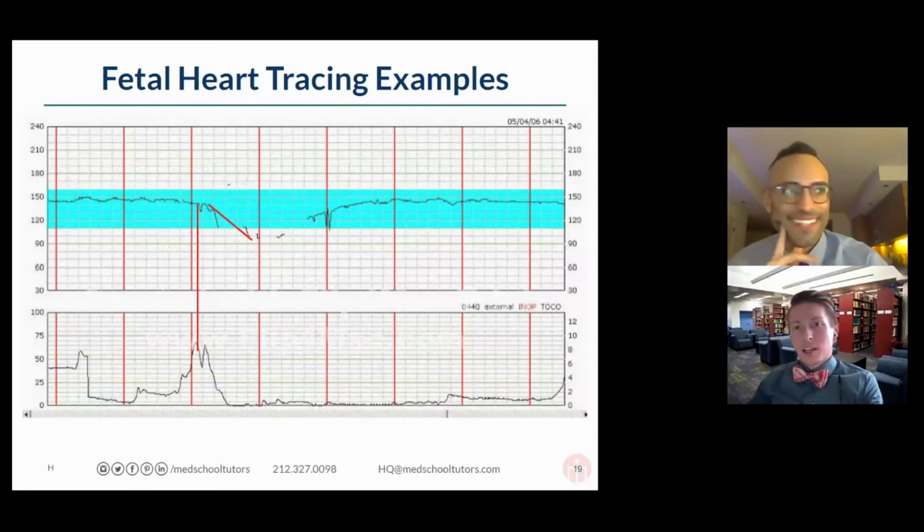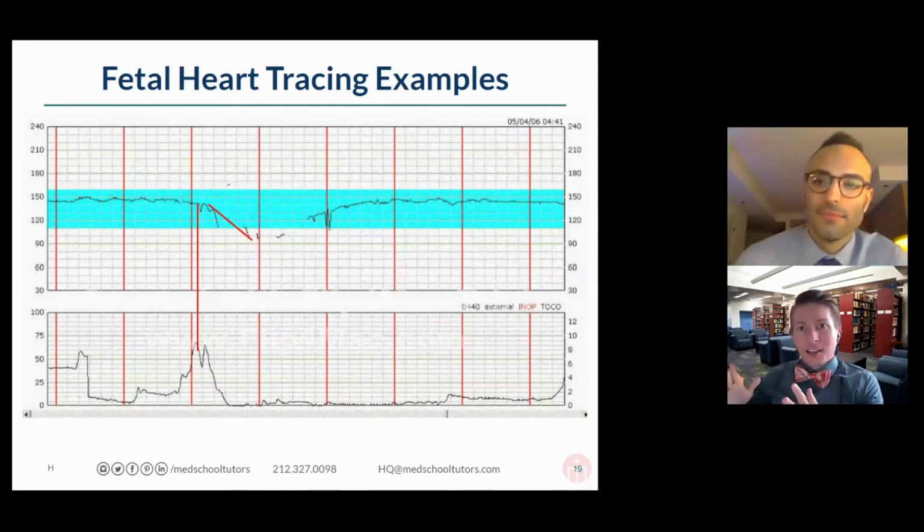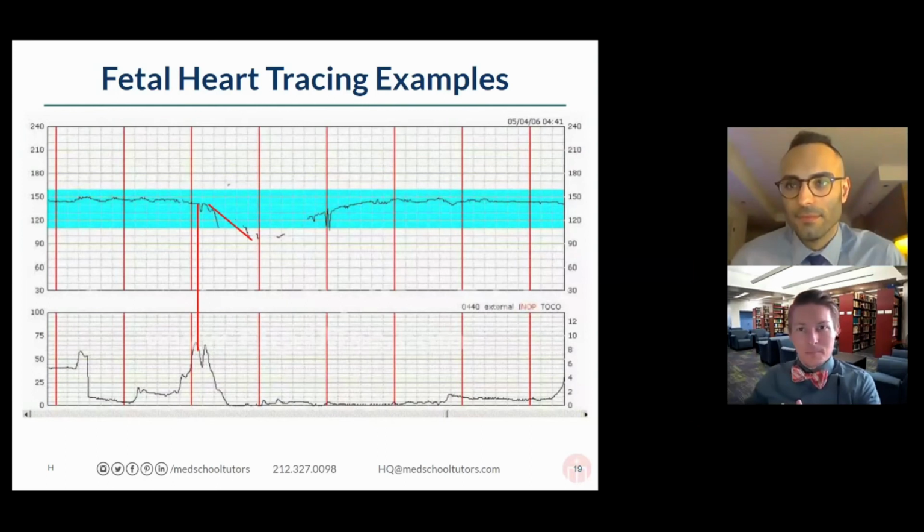And that is an ultrasound that you will do of the uterus and of the baby to look for a variety of things, including the baby moving around, attempting to breathe, and the fact that they have enough amniotic fluid. And that is correct. That is the answer nowadays. But there's also something called a contraction stress test, where you can supply oxytocin to the woman to give her a contraction. And then you can look at the fetal heart rate and see if that contraction precipitates a deceleration. So by giving oxytocin, you can literally view a deceleration because you can't see the decelerations unless she's contracting.